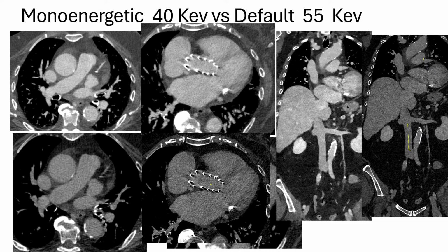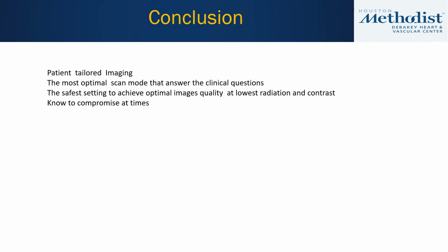As you can see, with the integrated, polyenergetic imaging, there's a little bit of contrast. But if you convert to a virtual monoenergetic, you can see the contrast signal much better. So there's a whole potential in patients with chronic renal disease that can only receive lower contrast. We haven't explored this too much yet, but it's a huge potential.